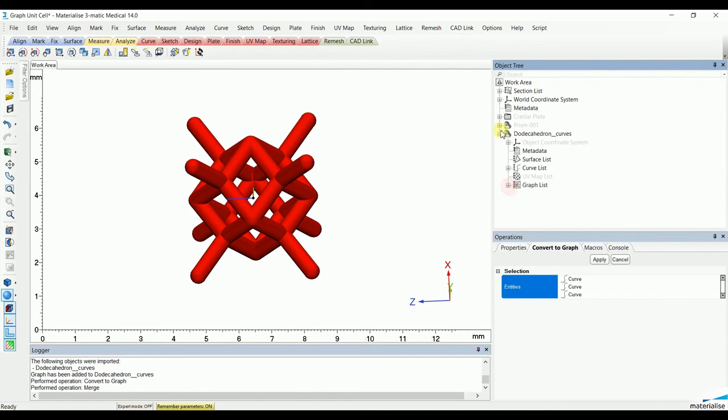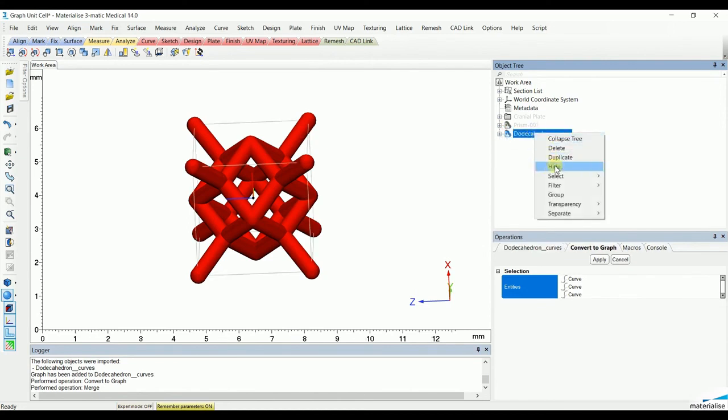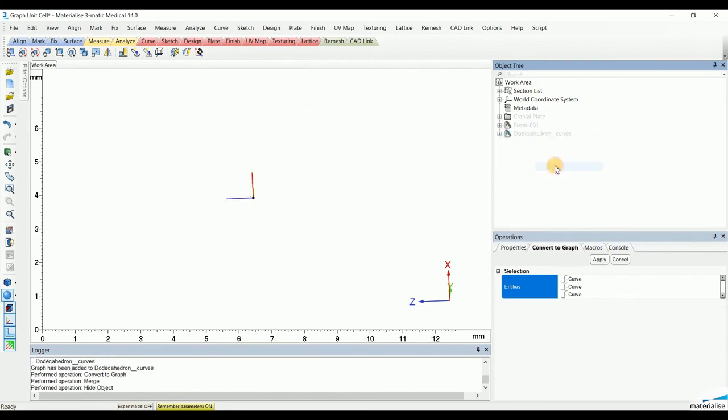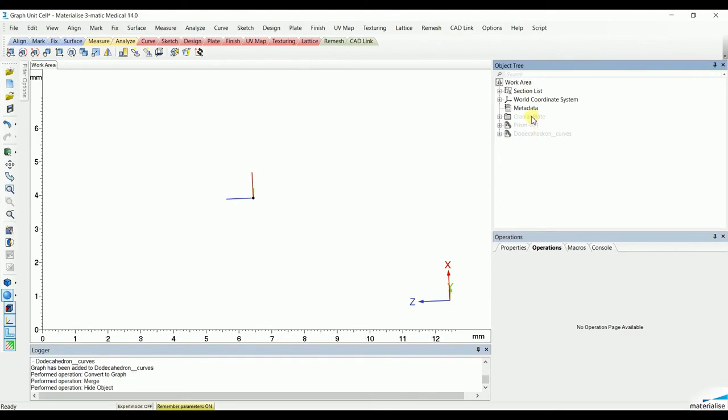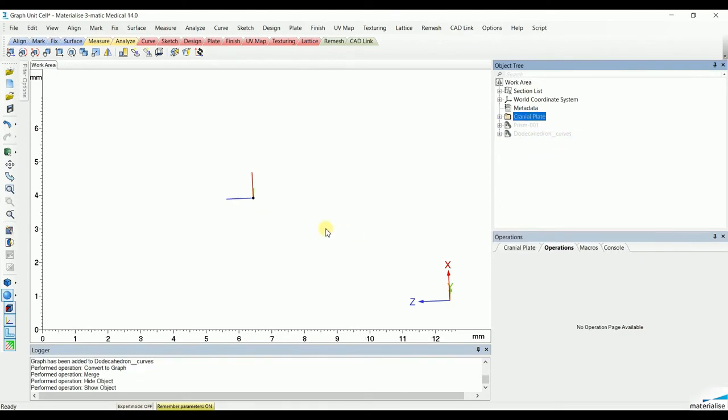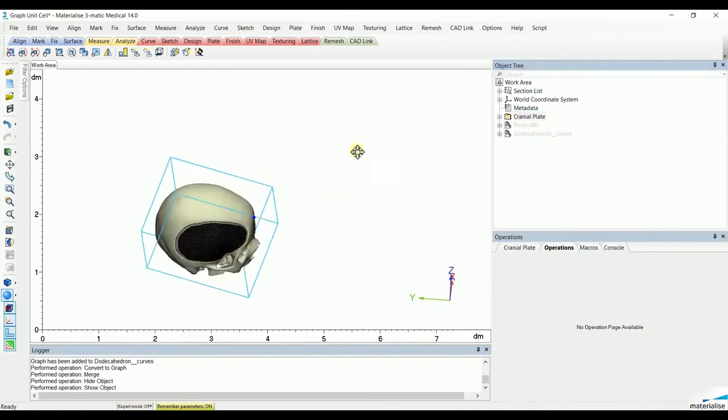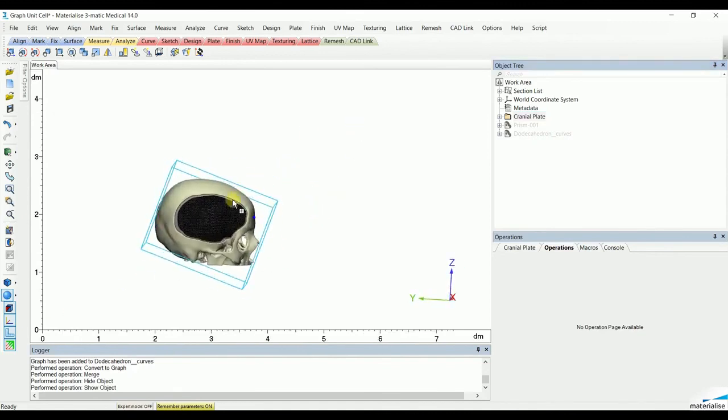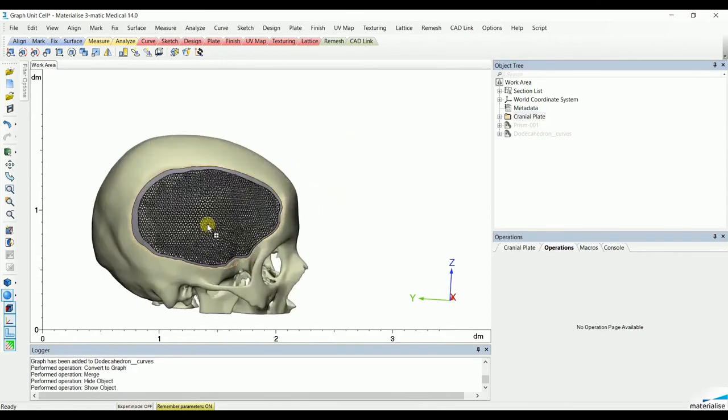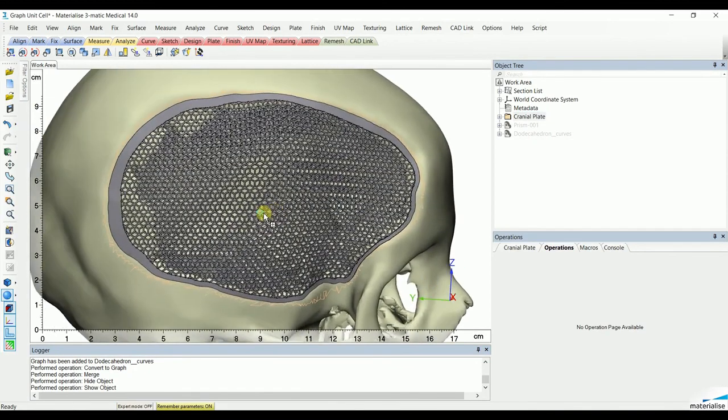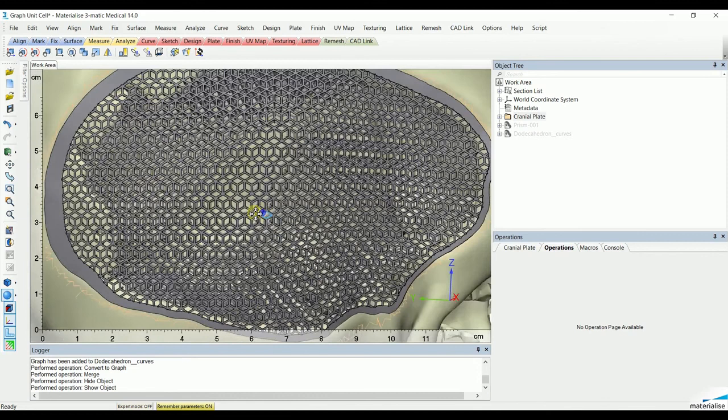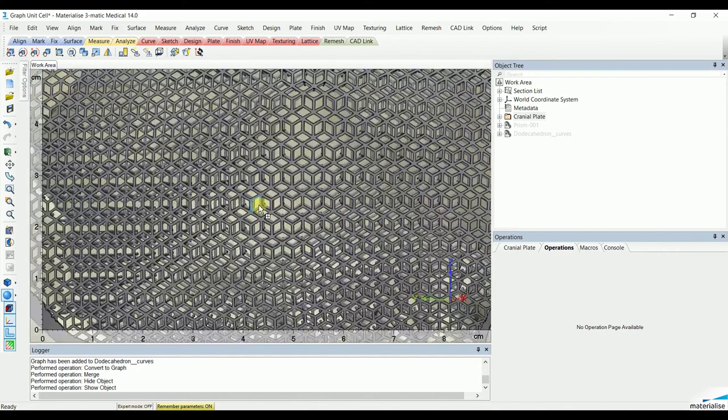These were the two different methods of how you can create and adjust your own graph unit cell, and these can be used in a range of medical applications. For example, a cranial plate with a porous structure. This one specifically uses the honeycomb structure we just created in this video.